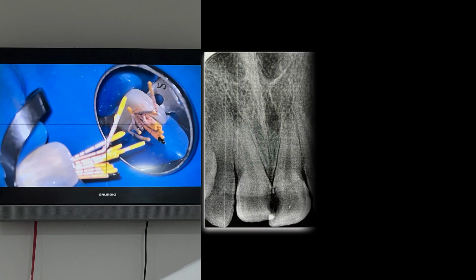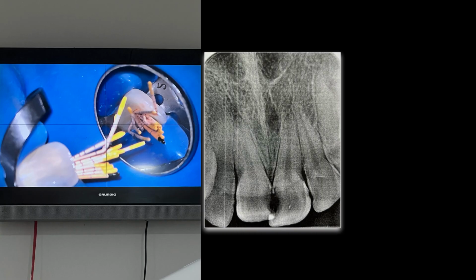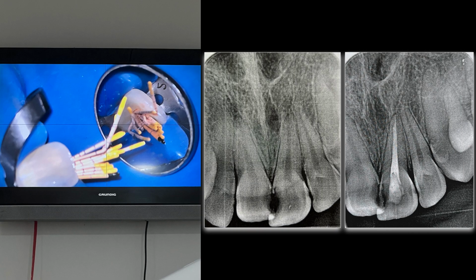So the next step is that I insert the same guttapercha size 40 taper 2 to have a positive tug back, with the bioceramic that's available in our teaching center hospital. Luckily, it's not available every time. So I insert a mini 20 hand taper 2. So here is the preoperative and here the postoperative. So we have exactly apical tug back, with a very nice middle and coronal sealing.